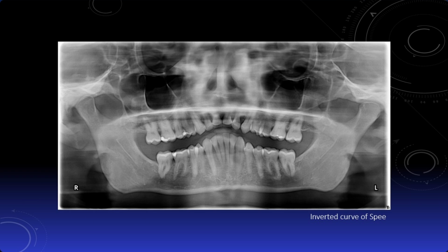If the patient's chin is tipped up too high and their horizontal Frankfurt or tragus ala line is not horizontal, you'll see an upturn in the curve of the occlusion that will look like this, and the inferior border of the mandible will appear very, very flat.